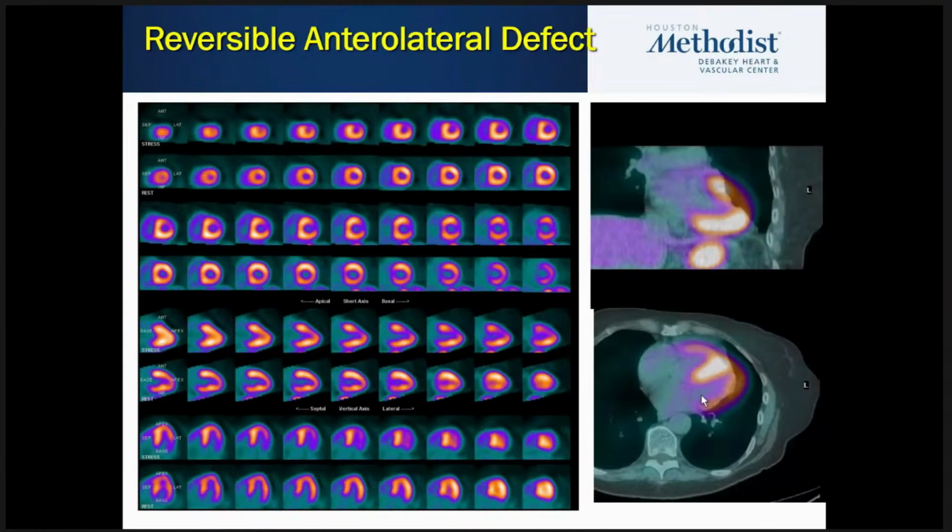The heart doesn't sit over the lung. The heart is where it should be, but the patient moved in between the acquisitions of the two images. Thus, when I fuse them, the images are laid on top of each other. This is why I know that this is inducing a defect, because the attenuation correction, instead of helping me here, resulted in an artifact.